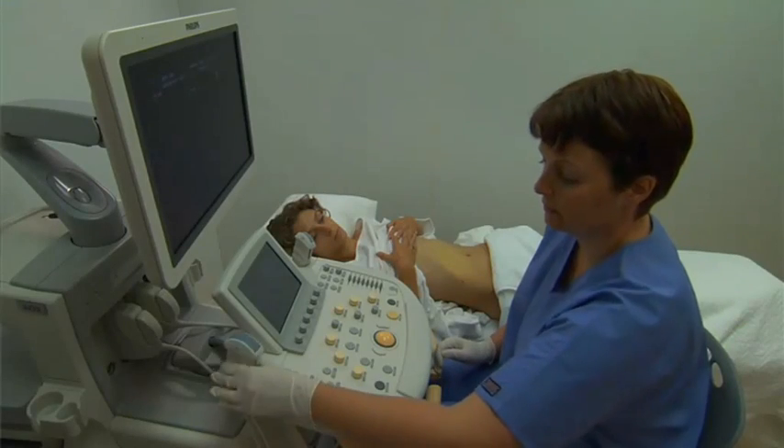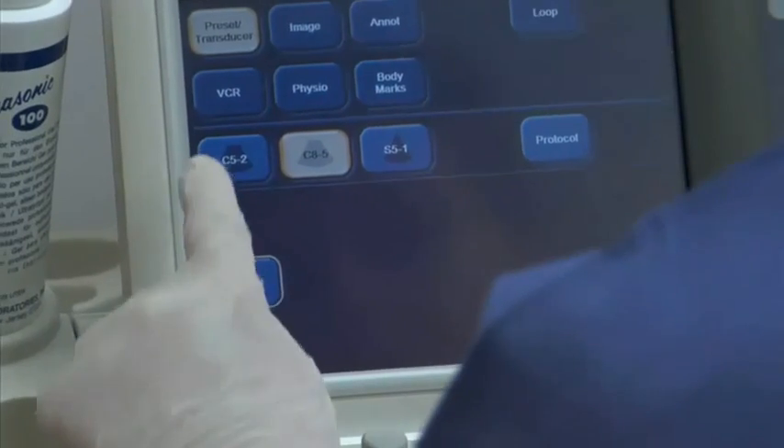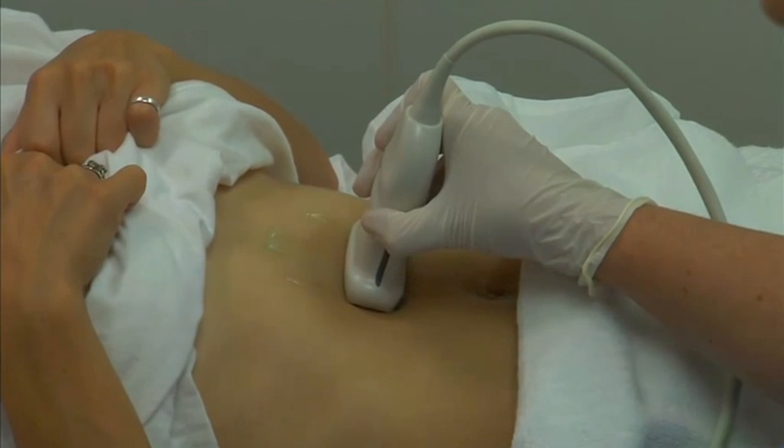Select the appropriate frequency transducer and confirm the correct transducer selection and preset on the ultrasound machine. Perform a survey scan and note any obvious abnormalities or pathology.